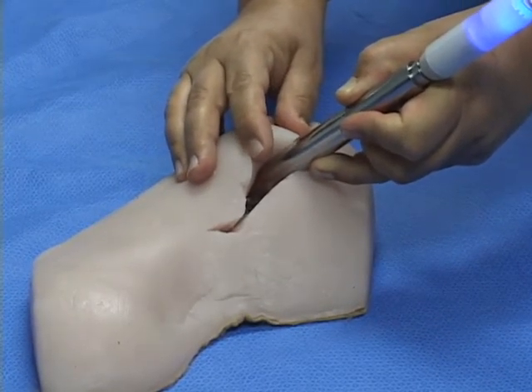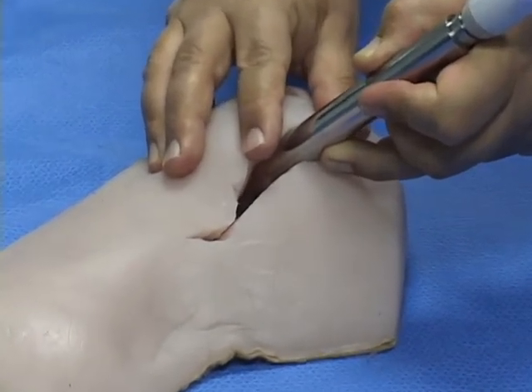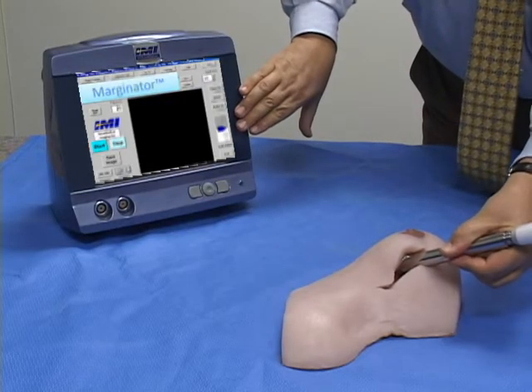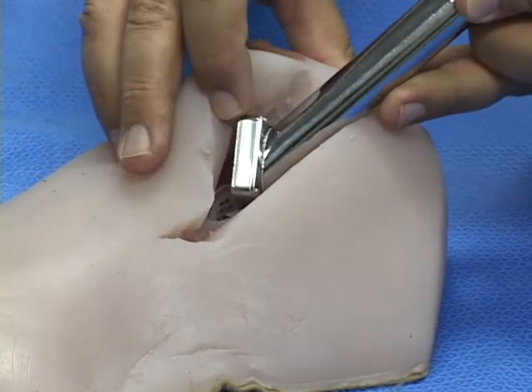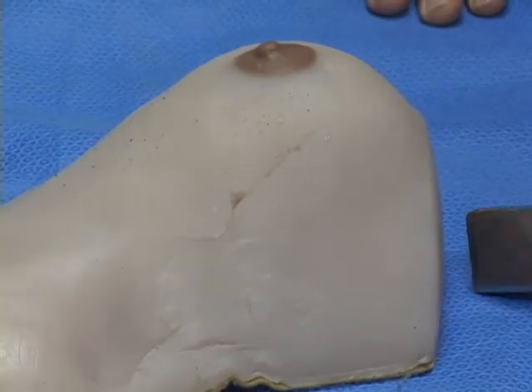I have placed a marginator over a clear area of our patient's breast and after 10 seconds the image has remained clear, indicating that there is no radioactive tissue in that area. Using the marginator, the surgeon is assured that there is no residual tumor remaining at the conclusion of the procedure.